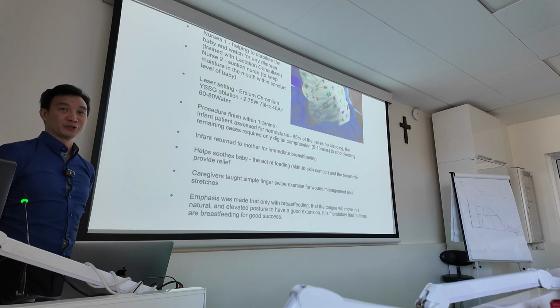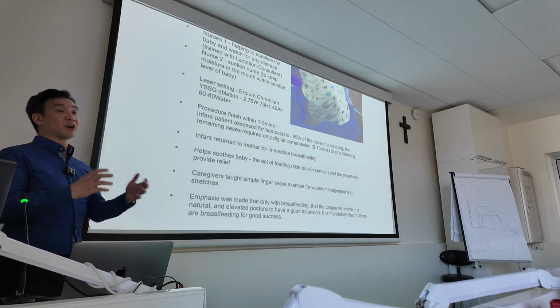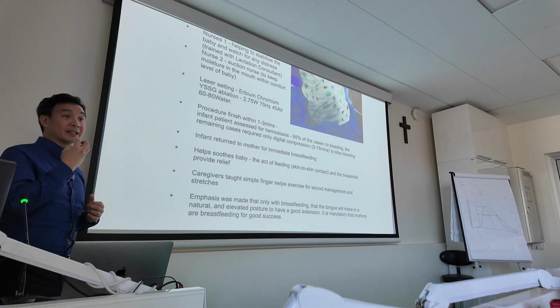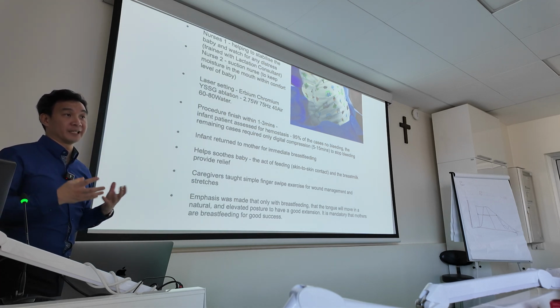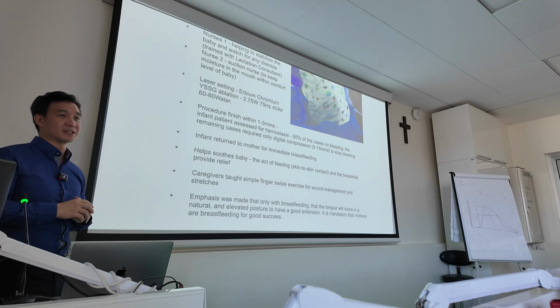Diode is a very good tool, but anyone starting with it runs the risk of thermal damage to the area, I feel. Even the more senior users, we have one pediatric dentist, occasionally see cases where you can see it is due to thermal damage that the salivary gland is blocked. So it's a risk. Too much heat.